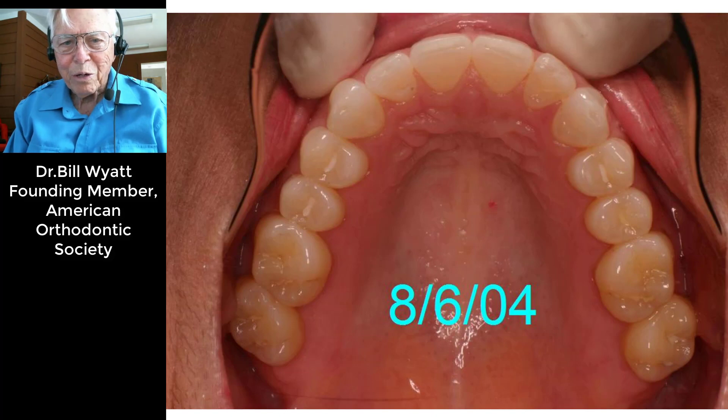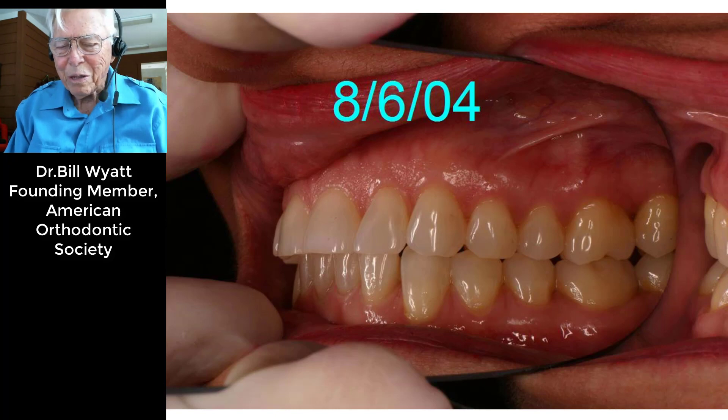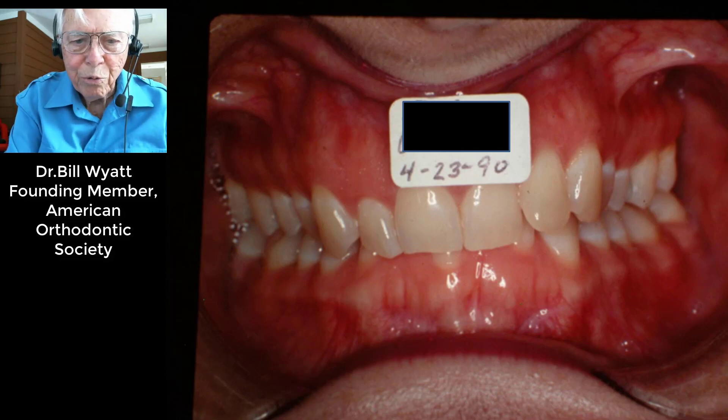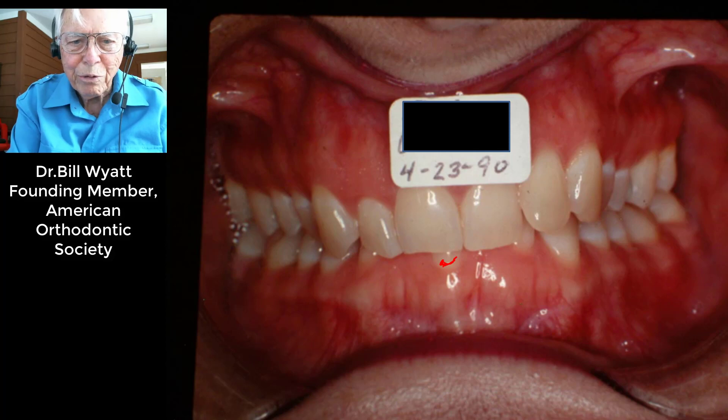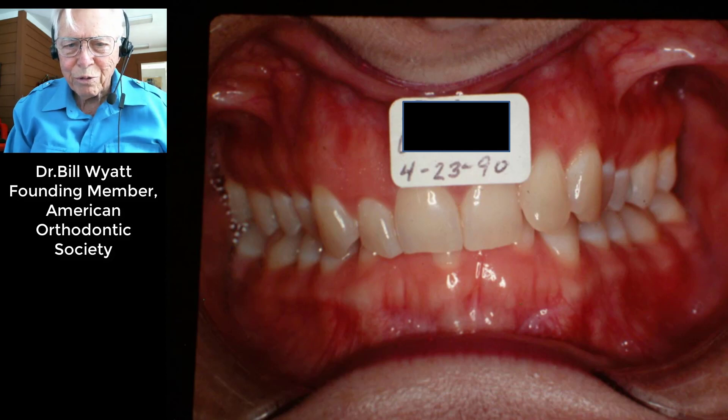Her teeth look almost perfect here, and that's her three-to-three — we bonded in there and she had a beautiful set of teeth. Going back to 1990, here are her teeth: she had a terrible deep bite in which she had one lower anterior tooth that was crowded completely out of the arch. I'm going to discuss the expansion of the arches, which is what we're talking about in these five cases.